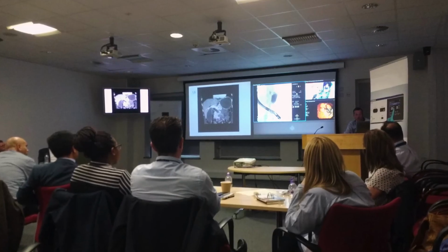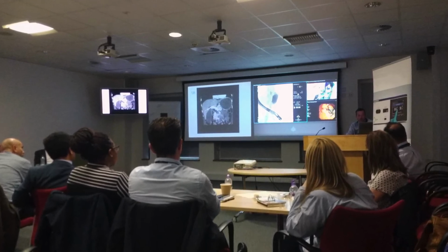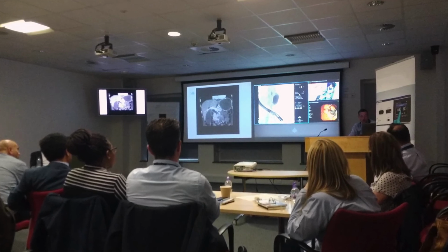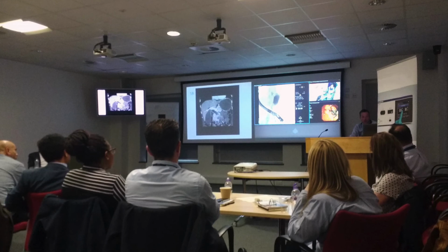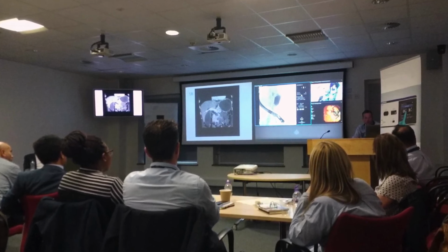Recently, at St James's University Hospital, Leeds, in the United Kingdom, a networked medical video system was delivered to the endoscopy suite. This allowed cameras within the endoscopy rooms and the endoscope image itself to be shared across the Trust network. This content is received on a Trust laptop that is authenticated on the network and can be shared for conferences and for teaching on-site or even remotely.